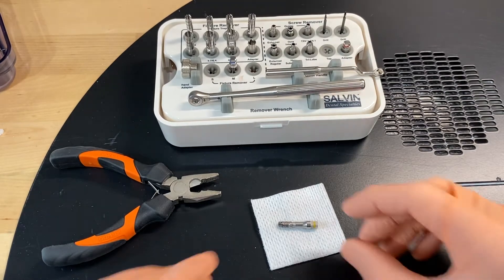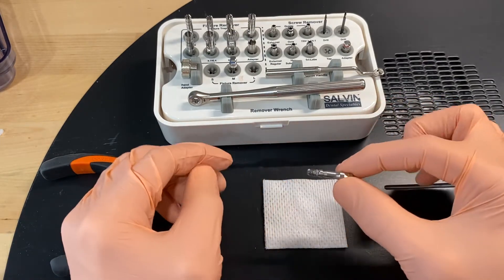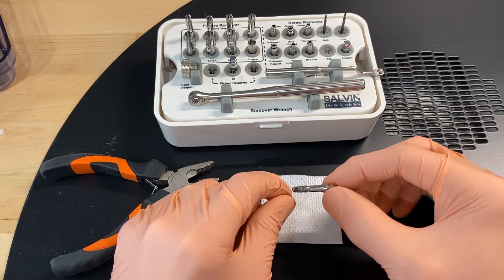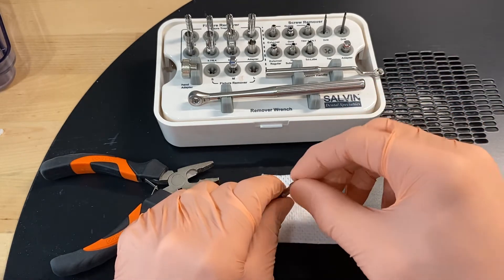Today I'm going to show you how to take the implant removal tool out of an implant. We've removed an implant with this removal tool, and this removal tool has a left-hand thread, so that means to get the implant out it has to turn counterclockwise and drive into the implant.